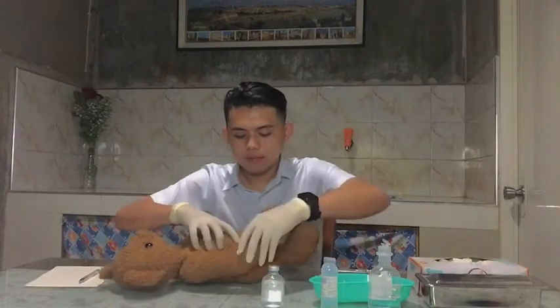Now, assist the client to a position in which the arm or leg or abdomen can be relaxed, depending on the site to be used. This is to provide comfort. So now obtain assistance in holding a cooperative client, and since the patient is being cooperative, we don't need to have any assistance at all. Next is explain the purpose of the medication, the language, and the effects of the medication to gain the patient's cooperation.